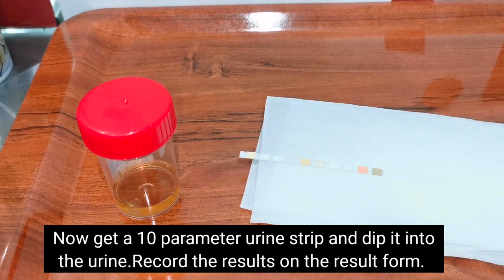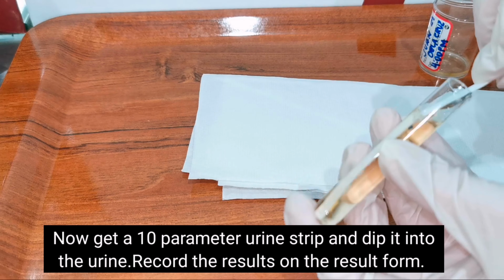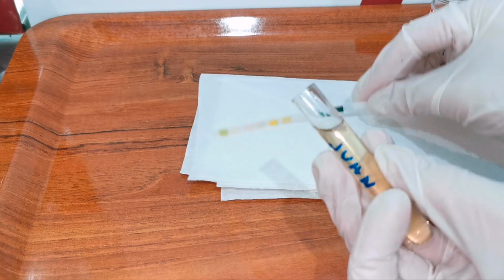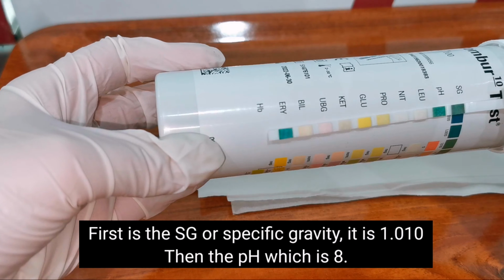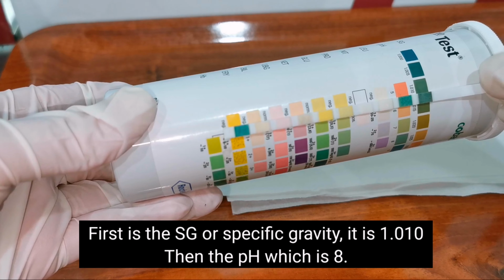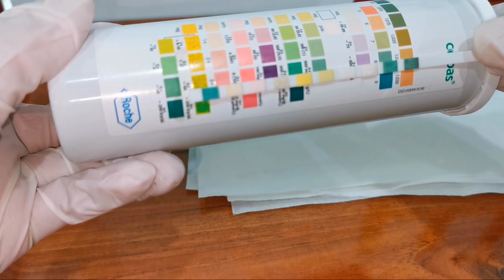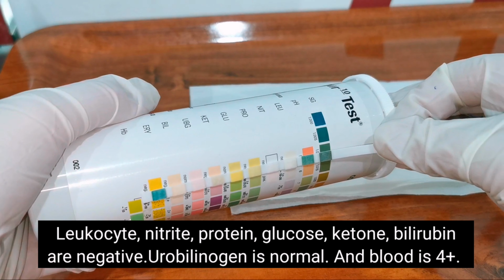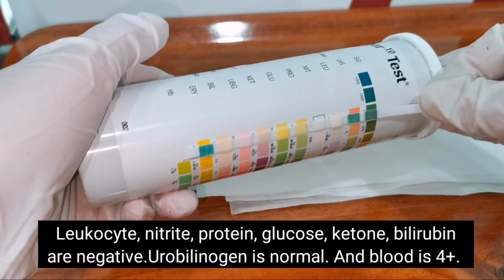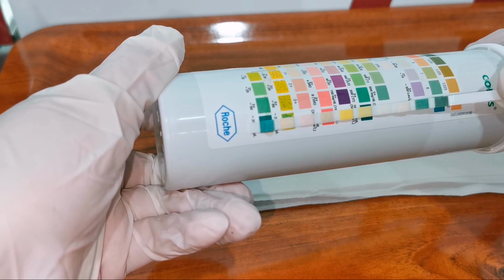Now get a 10-parameter urine strip and dip it into the urine. Record the results on the result form. First is the SG or specific gravity, it is 1.01. Then the pH, which is 8. Leukocyte, nitrite, protein, glucose, ketone, and bilirubin are negative. Urobilinogen is normal. Blood is 4+.